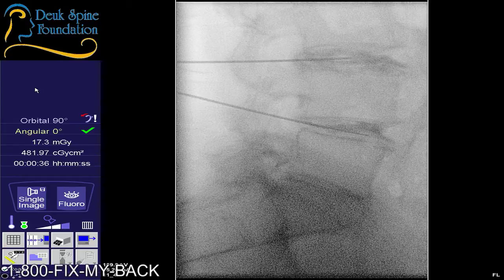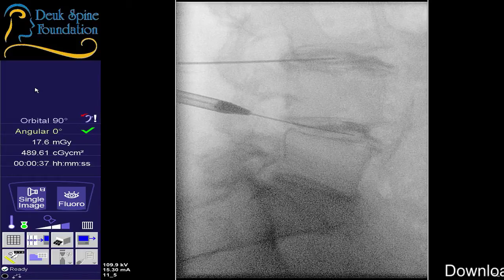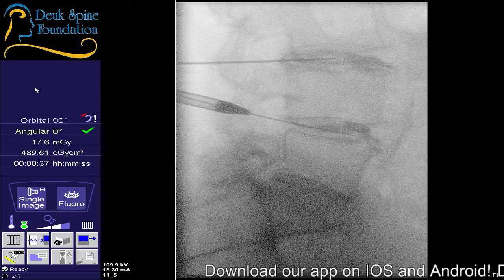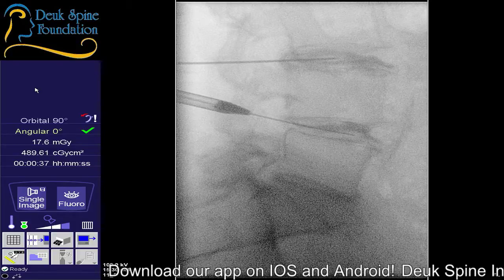Lots of people have back pain, but most back pain doesn't come from the herniated disc. It comes from the facet joints. Those are little joints. If you look at the dilator I just put in, it's passing the facet joint right now. If you look just below the tip of that pencil on the left there, there's a little mass of bone. That's the facet joint. That's the most common cause of back pain, but not in this patient. For this patient, it's actually the annular tear.